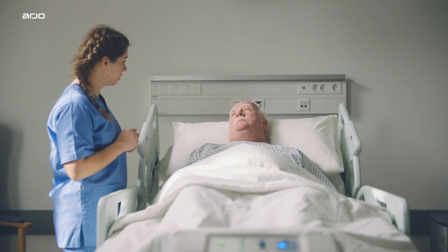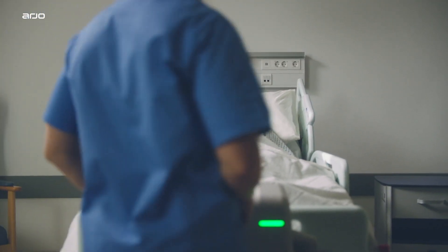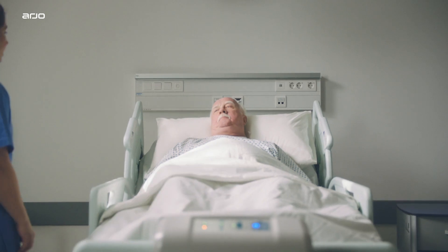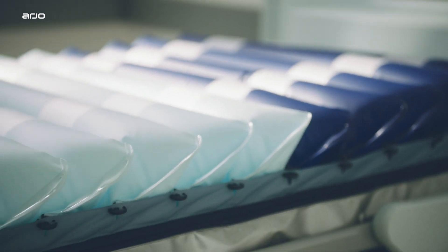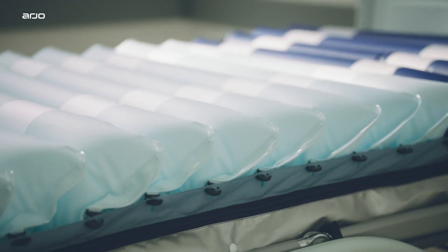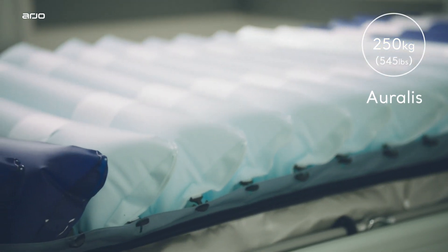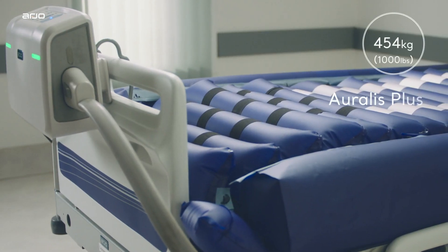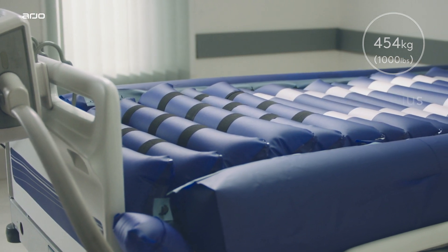The Oralis is contraindicated for patients with unstable spine fractures. Any other unstable fracture will require advice from the appropriate clinician before use. Those approaching the upper weight limit are likely to have additional care and mobility needs and may be better suited to a system with a higher weight limit such as the Oralis Plus mattress.